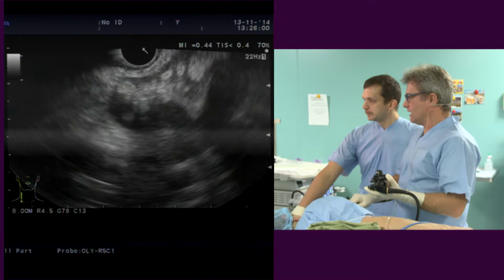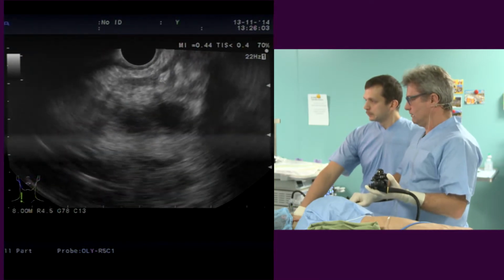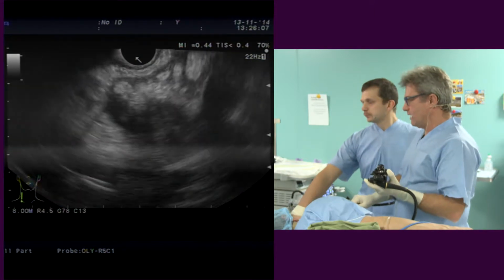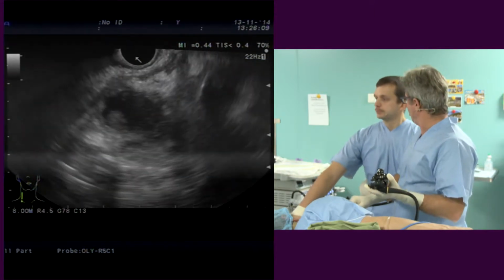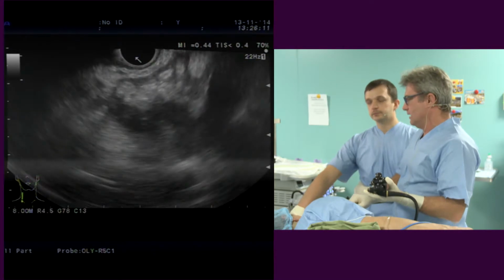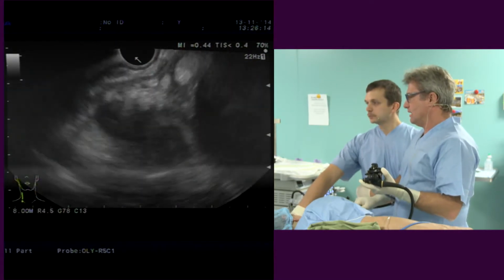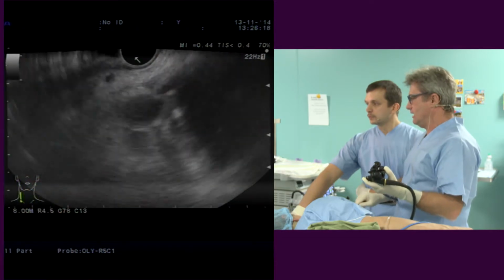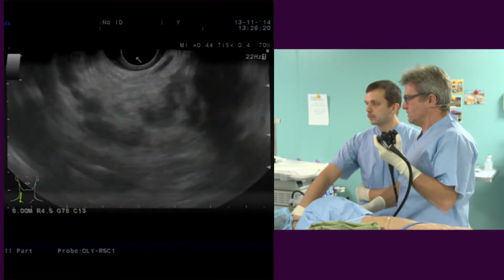Okay, so this is some calcification. So the pancreatic parenchyma is atrophic. It's not very well recognizable, if you compare with the exam before where we can see the parenchyma very well. Here it's atrophic, there's a lot of calcification, and here we lost it.